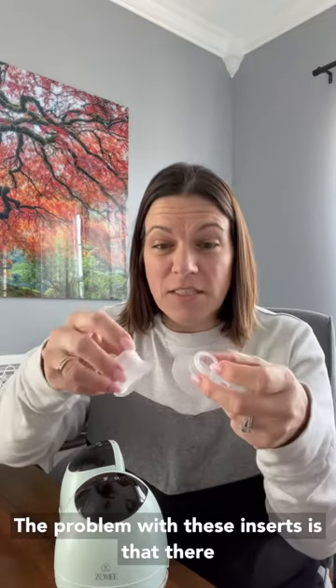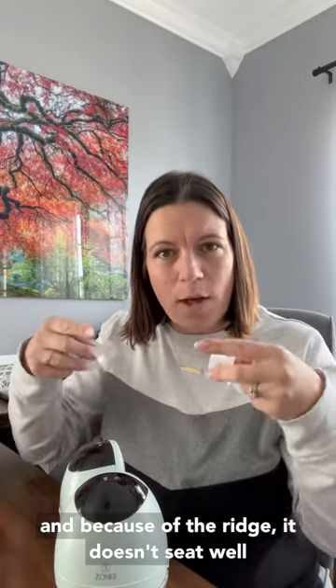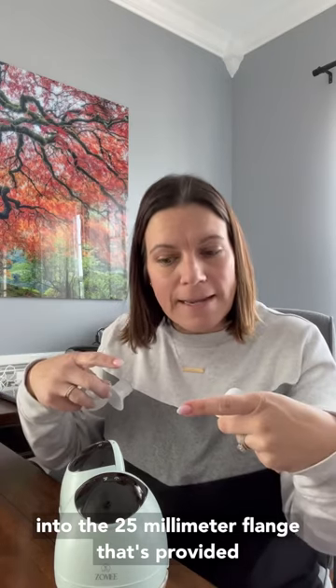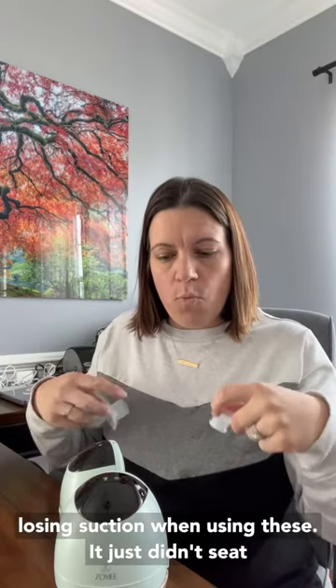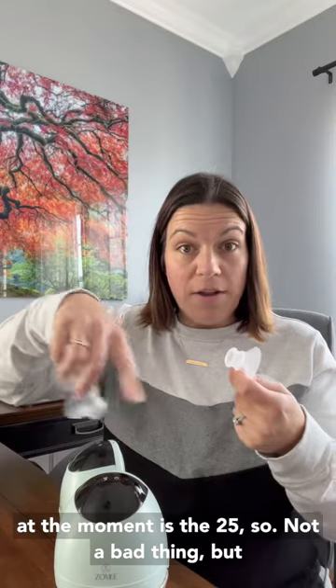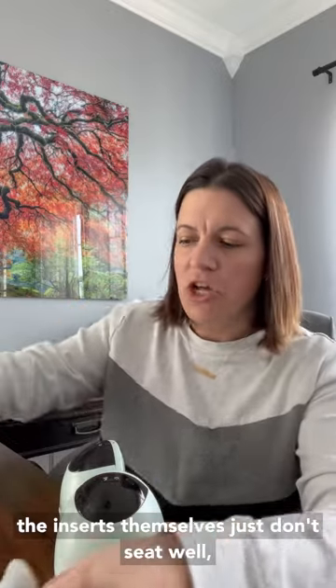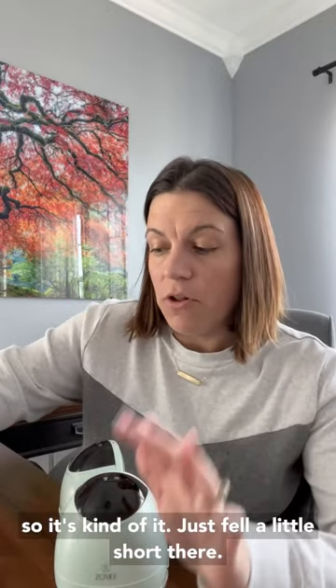The problem with these inserts is that there are ridges molded into the silicone. Because of the ridge, it doesn't seat well into the 25 millimeter flange that's provided. And because it doesn't seat, I personally was losing suction when using them — it just didn't suction well. It's kind of hit or miss. As much as I liked the idea and I'm glad they went down in size rather than up, the inserts themselves just don't seat well. The largest flange you can get with this, as far as I'm concerned at the moment, is the 25. So the inserts fell a little short there.